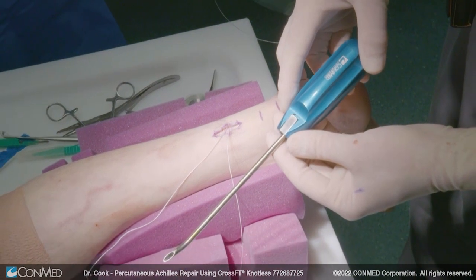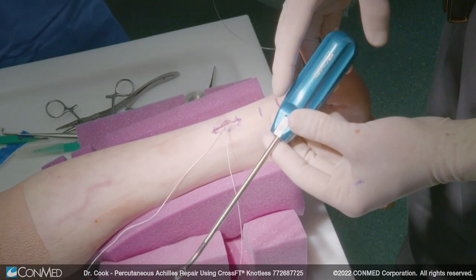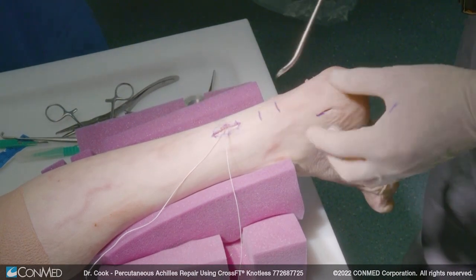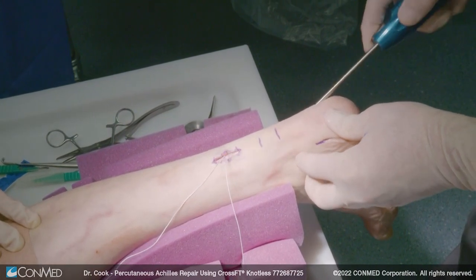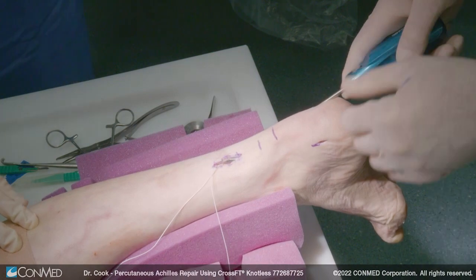What you're trying to do is gain entrance into the sheath from both sides. We're using the curved drill guide with a super shuttle pass through the end, and we're just going to run this up through the sheath to our proximal wound. Now we're in the proximal wound — we just verify that we're in the sheath, and we are. You can see that very nicely.